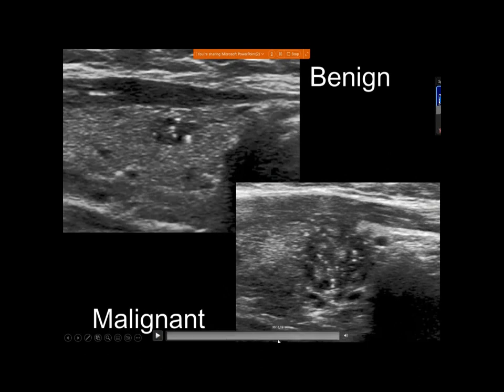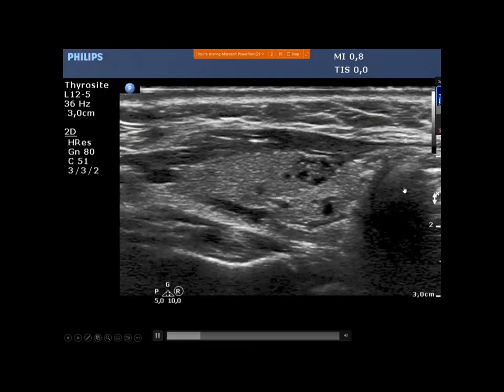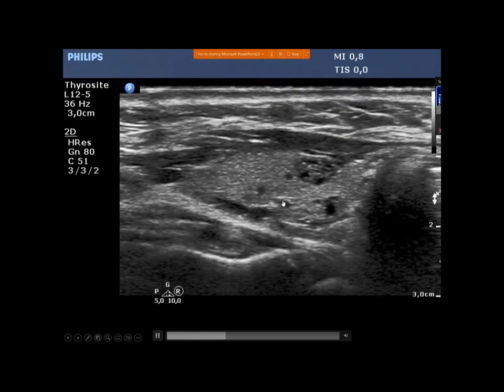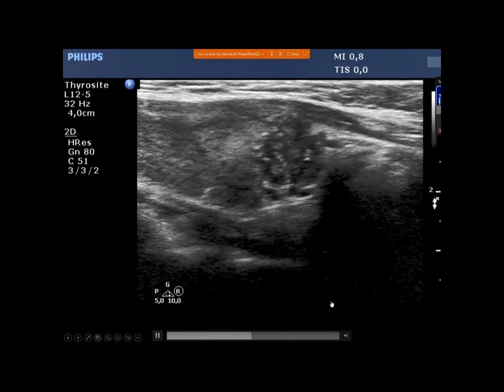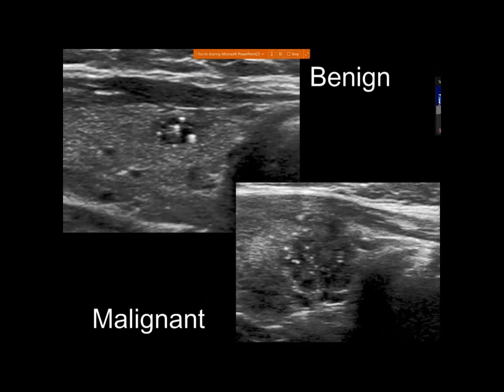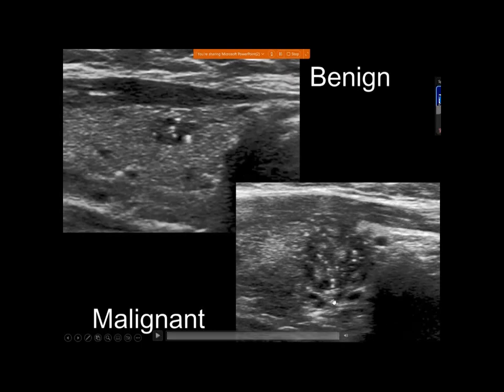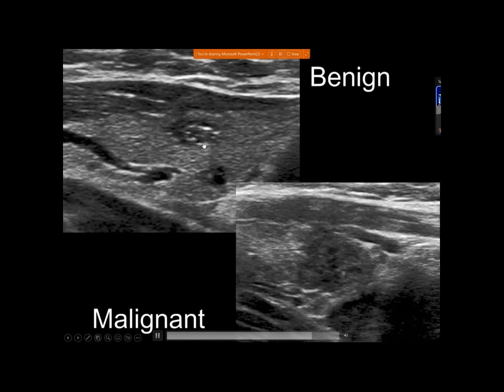If we take the entire presentation of the lesion, or the lesions, into account, this is two different stories. So this is the benign, and that is the malignant nodule here. So these are very likely comet-tail artifacts, here that one. If you focus on this figure and that one, this is two different figures, the ventral and the dorsal. So this should not be mixed up with a comet-tail artifact. A comet-tail artifact is a single form, a single one.